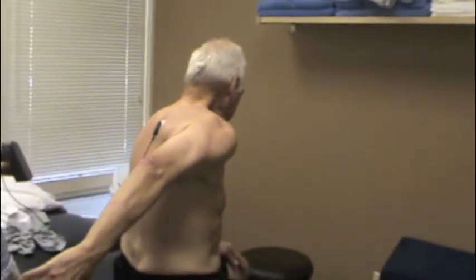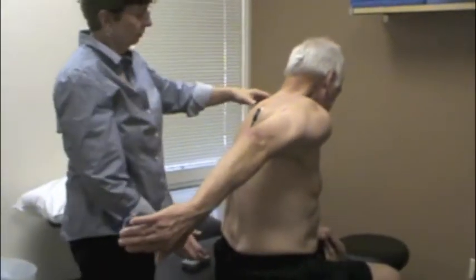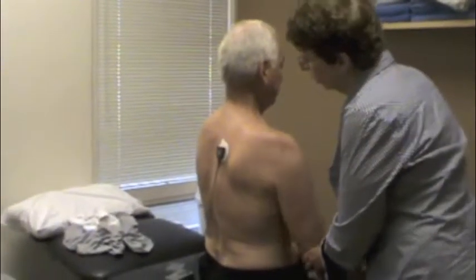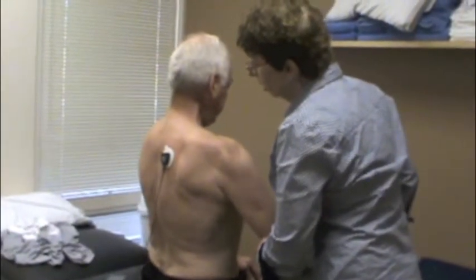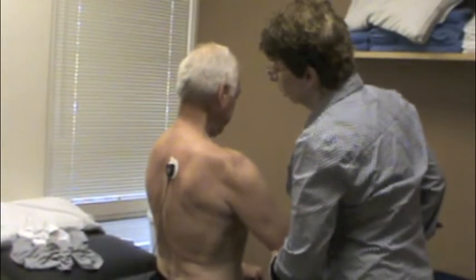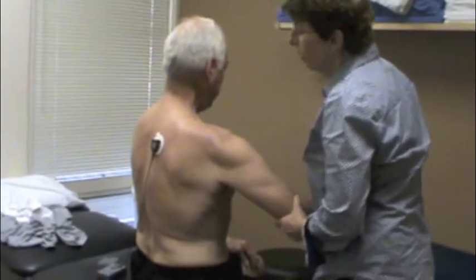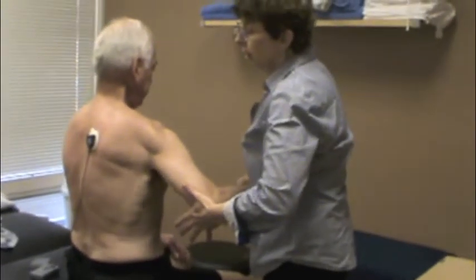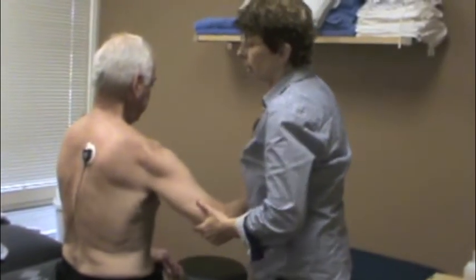Really, yeah — that's it, up real straight. Hold this arm here and try to get that muscle to come in, and let's hear it. There we go. Hold it, good. Hold it, good. Now what I'm going to have you do this time is I'm going to resist you coming back this way. There we go, good. And again, good.